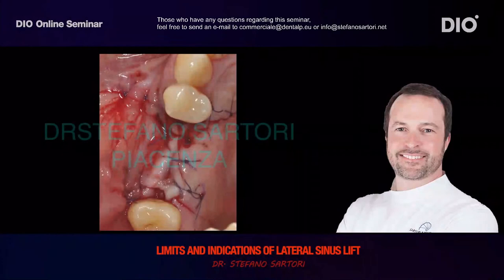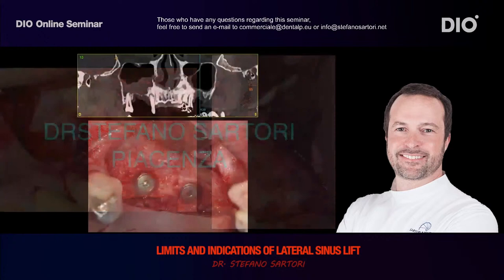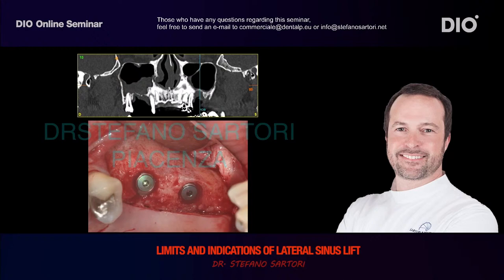These are the sutures, and this is the left side. Even here, look at the quality of the tissue, look at the amount of regeneration. You don't see the corticotomy anymore, complete restitutio ad integrum. And look in the next slide at the quality of the tissue. I show you in a higher magnification.